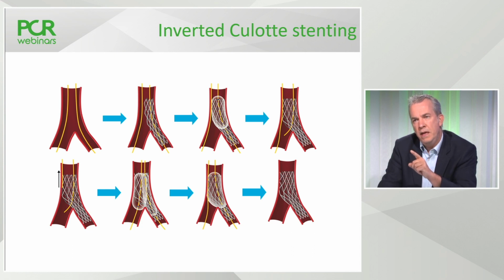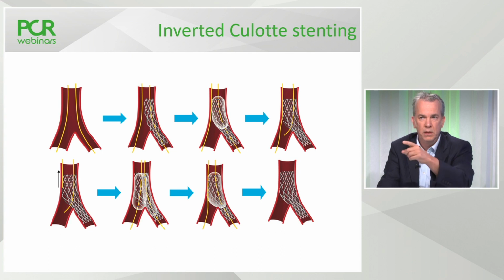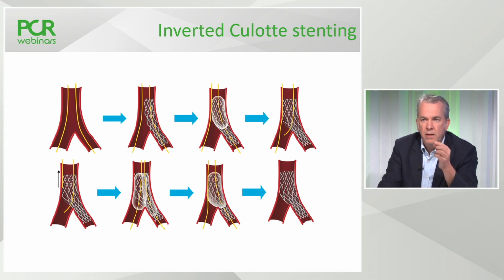That means that the stent in the fourth image is expanded proximally, and it's also bowed out into the ostium of, in this case, the main vessel. And you can see the wire there is used to cross that stent as distally as possible.